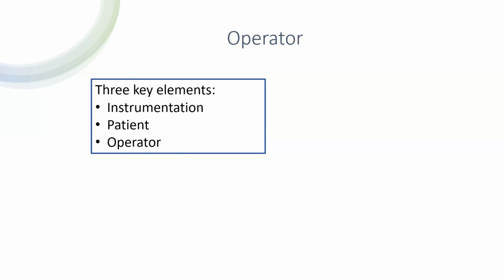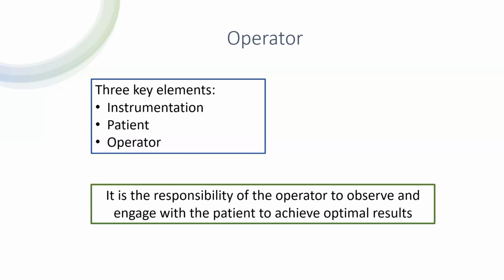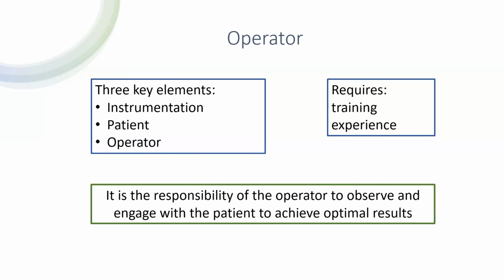Patients also felt that it was important that the operators did not express disappointment when the patients have trouble completing the test. And though many felt that the encouragement or coaching is very important, some patients would rather have preferred a gentler approach rather than shouting instructions to blow. It is the responsibility of the operator to observe and engage with the patient to achieve optimal results, which requires a combination of training and experience, hence today's continuing education.